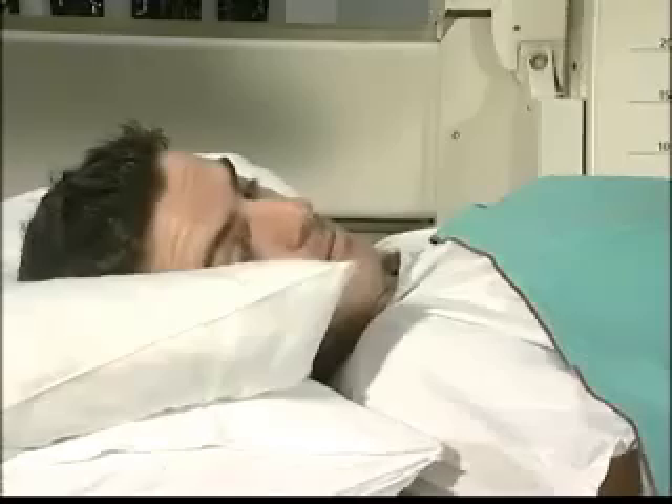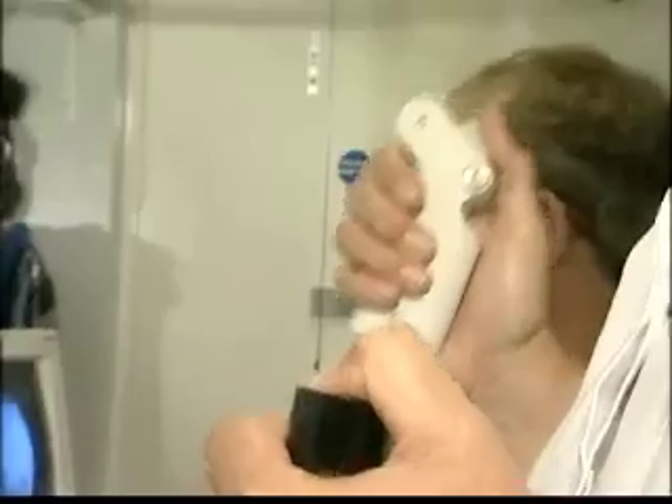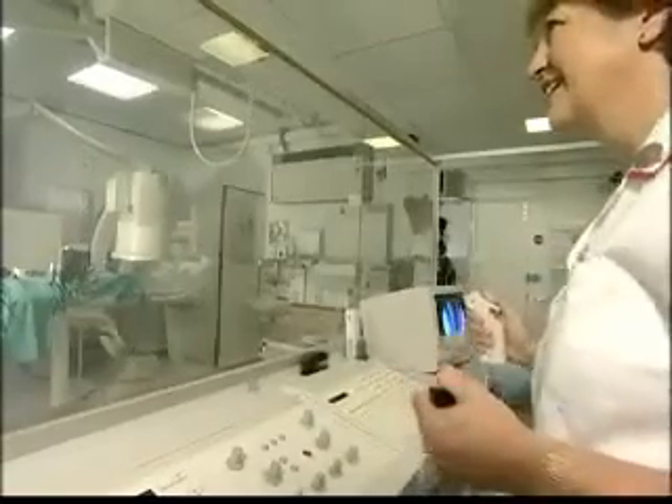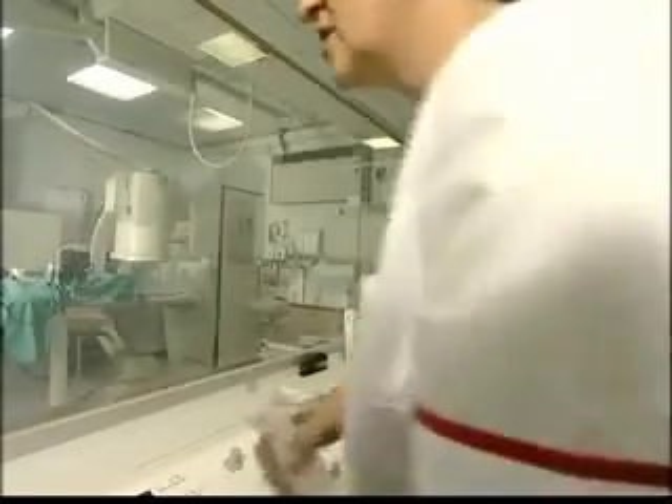You'll get that very warm feeling now and then the camera's going to move down your legs, so just keep absolutely still. Continuous digital images are taken before and after the injection of the contrast medium. When one is subtracted from the other, an image clearly showing the blood vessels is obtained.